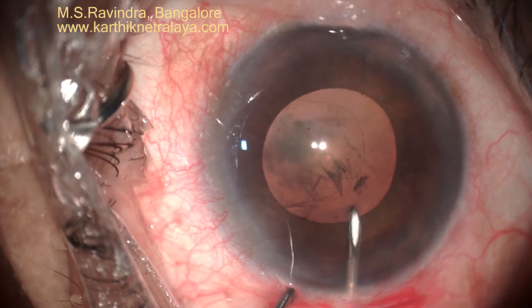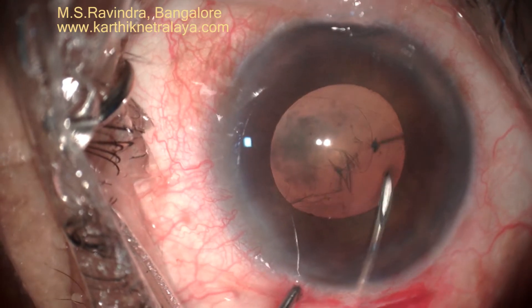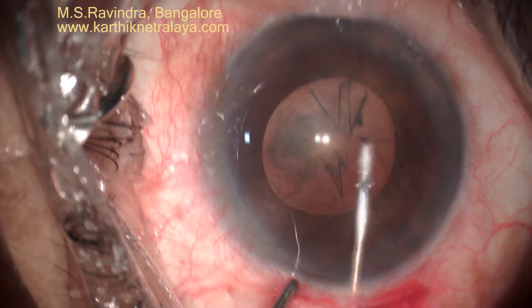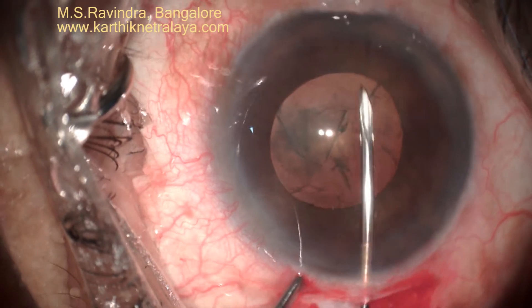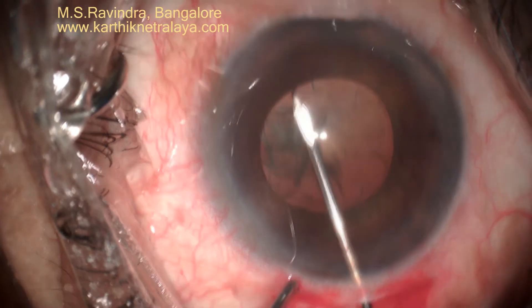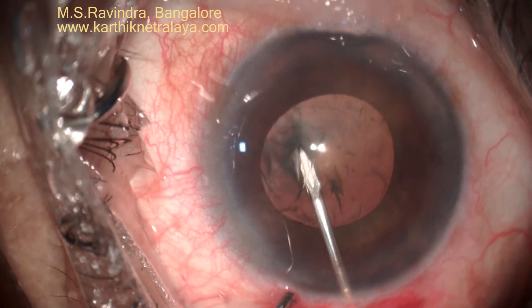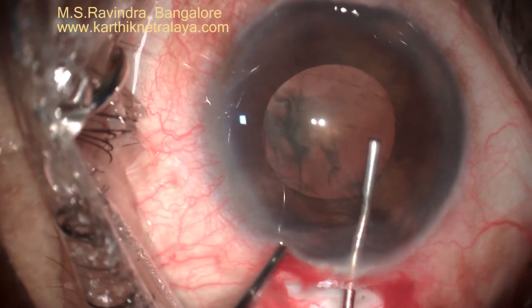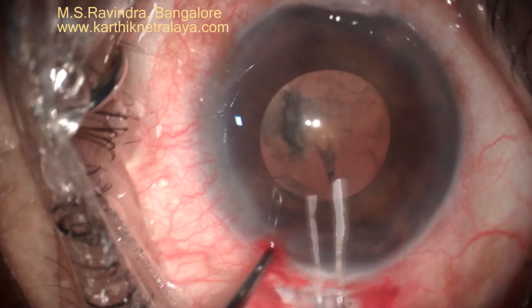Rhexis is made as large as possible, parallel to the pupil and slightly beyond the pupil margin. It could be completed in one go. This amount of rhexis is adequate to perform the surgery as it is a soft nucleus.